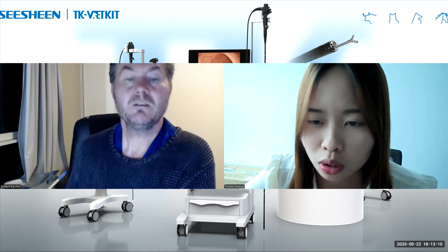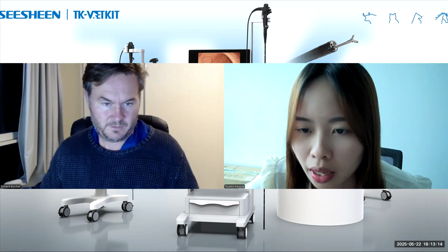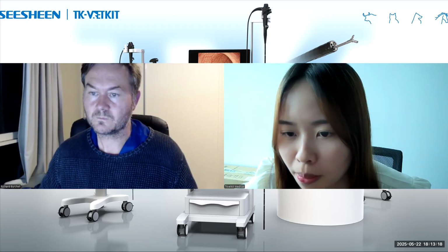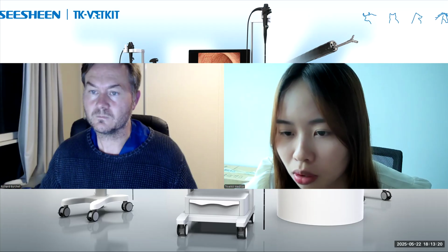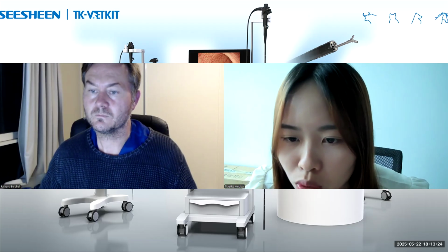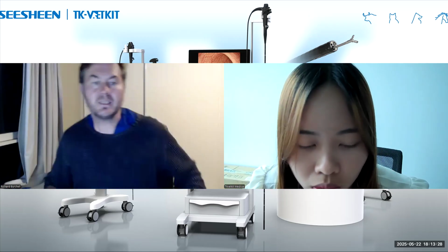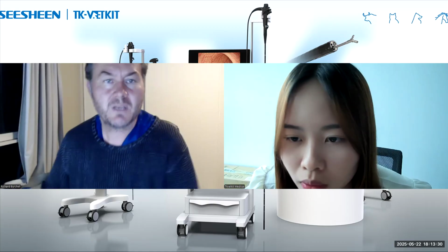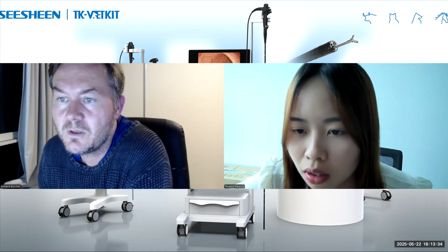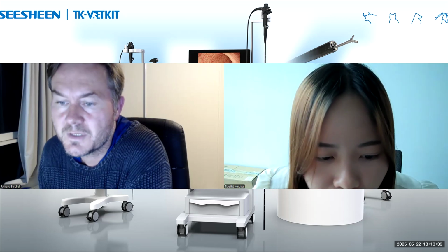Thank you, Dr. Burchell, and our participants. And another question is, do you pre-med with the bronchoscope? Sorry. Okay, I will send to the chat box. Yeah, sorry, I can see that now. Okay, I can see that there's more questions. And Tiffany. Yeah, so I've seen that.